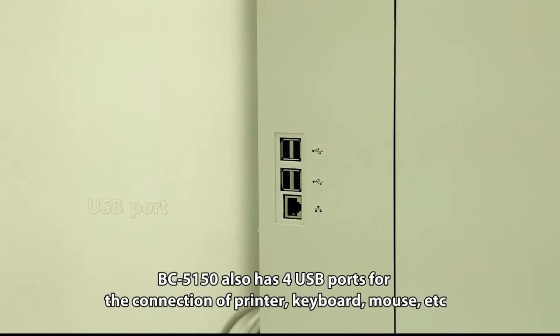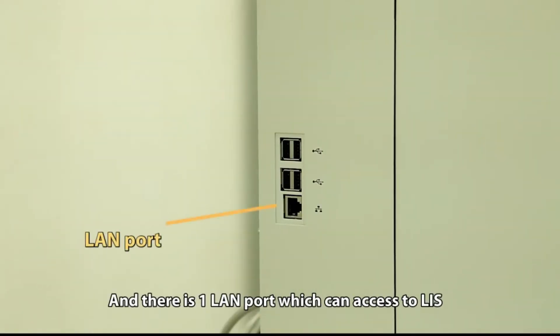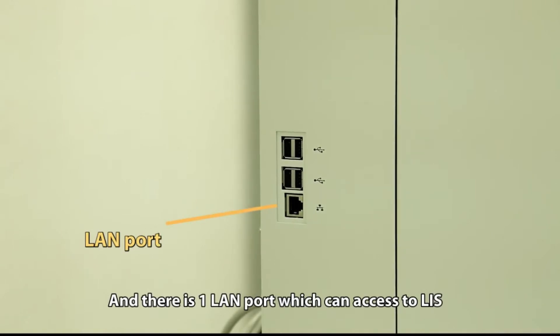BC5150 also has four USB ports for the connection of a printer, keyboard, mouse, etc. There is also one LAN port which can connect to LIS.